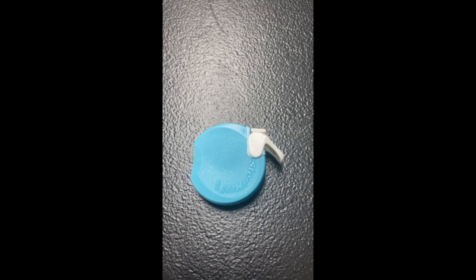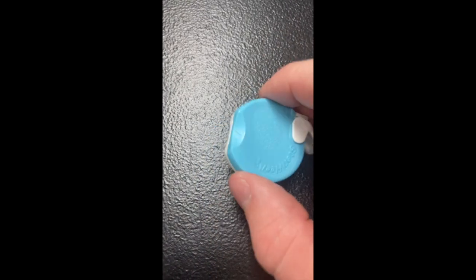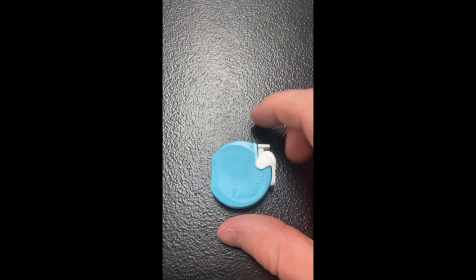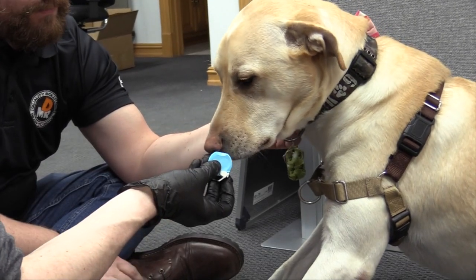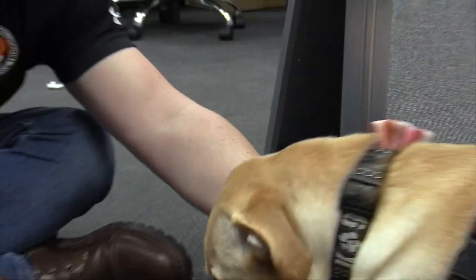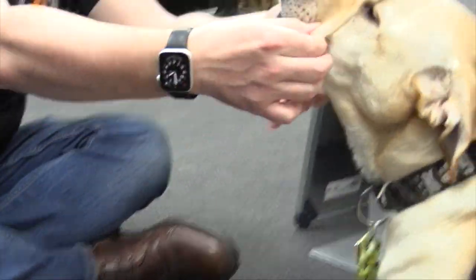This is the lancet that comes with the Belly Labs pregnancy test. The actual needle will shoot out of this end here. To use it, first disengage the safety into the down position, and to shoot the needle you simply press down. To do this, lift up the lip exposing the inside, then press the lancet flat and firmly against the lip so that the needle makes contact with the skin.